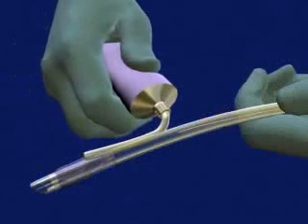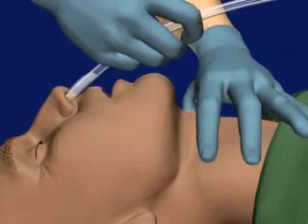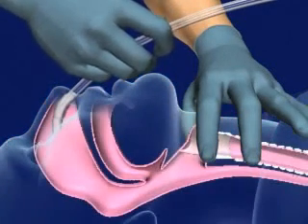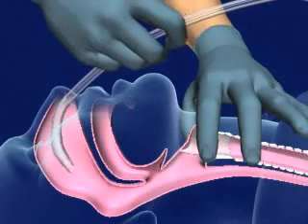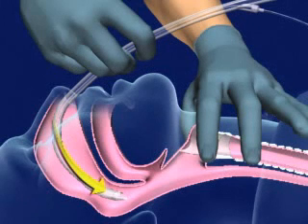Lubricate the tube with water-soluble jelly. With the bevel of the tube facing the nasal septum, insert the tube and advance it along the nasal floor. Position yourself behind the patient with one hand on the tube. Use your thumb and index finger of your other hand to palpate the larynx. The curve of the tube should follow the natural curve of the airway.